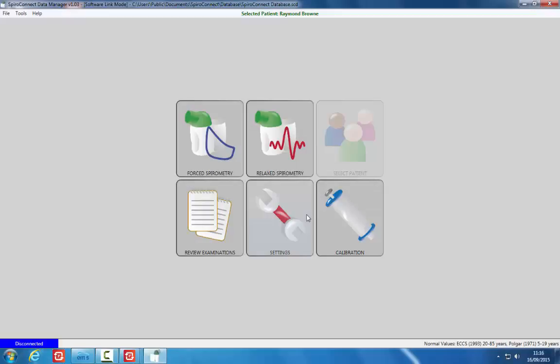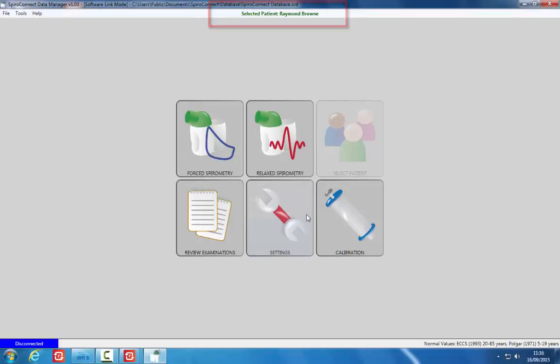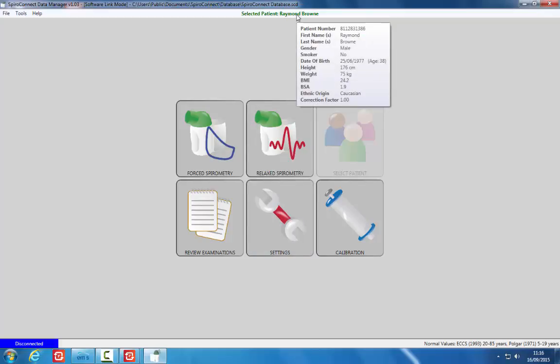As the spirometry software starts, you will notice the patient name displayed at the top of the screen. Hover the mouse over the name to see the full patient details.